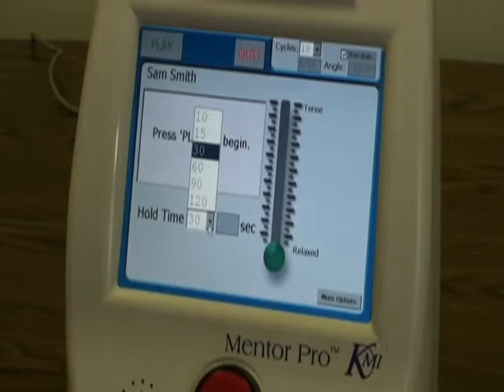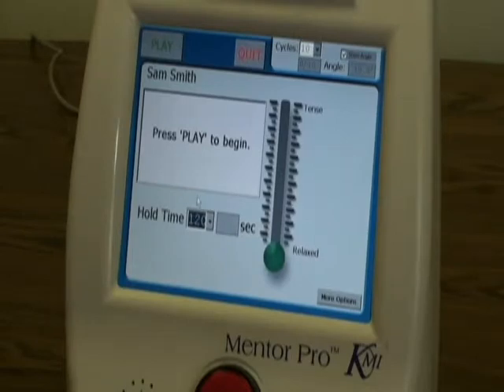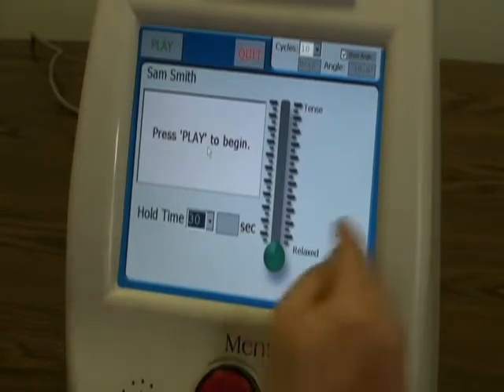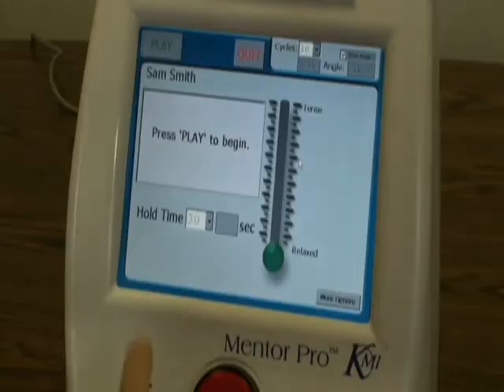Every time the patient's hand is raised, the scale of the visual feedback is adjusted based on the patient's performance on the previous cycle. If the visual feedback disappears too quickly or stays in the middle the entire time, this is not clinically relevant feedback. The visual display is constantly being readjusted so the patient sees the feedback for as long as possible during a stretch cycle. You can turn on or off the wrist angle display.